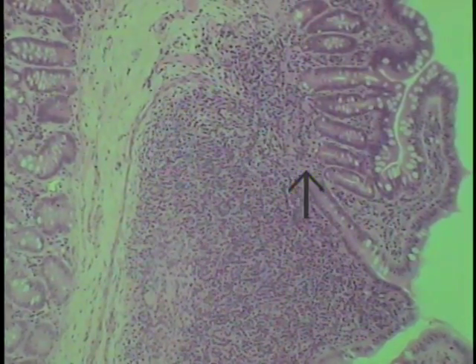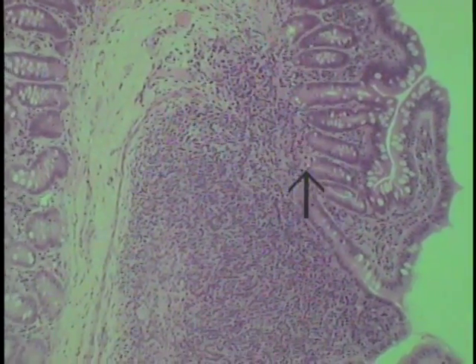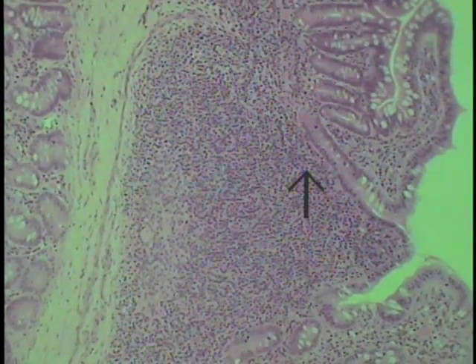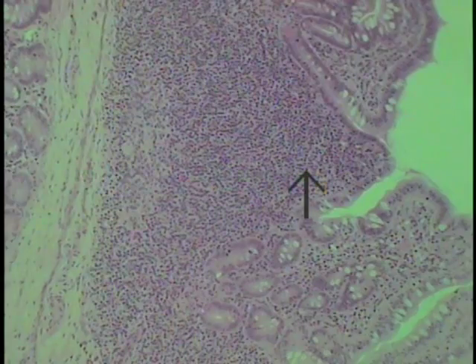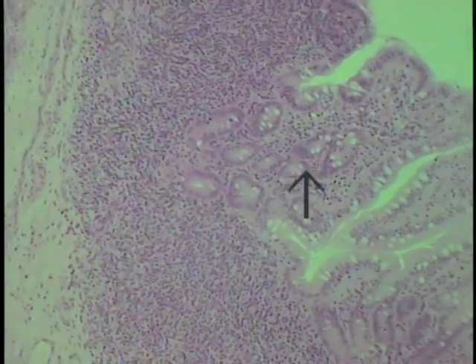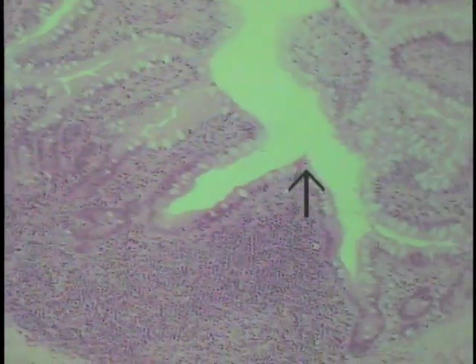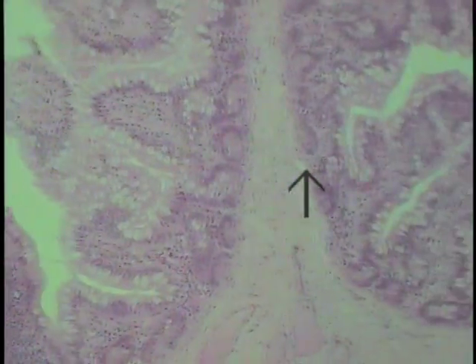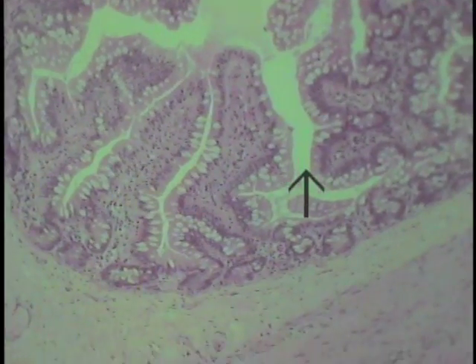So these are the Peyer's patches. Some people consider it characteristic of the ileum, but please be aware that the lymphoid accumulations are found elsewhere. And indeed, it is possible to get a section of the ileum that does not show these large lymphatic accumulations. Such a section is over in this segment, which is devoid of the Peyer's patches, though it does show, of course, the goblet cells.